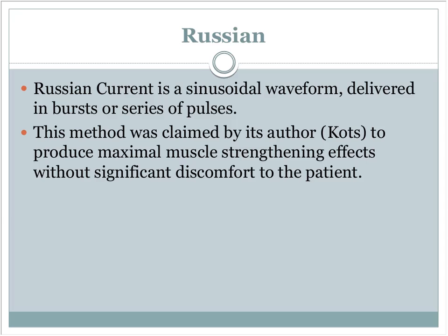If it doesn't work, try something else. It doesn't mean they won't respond to e-stim. It means they may not respond to that form of e-stim. That's why it's important to understand the waveform differences and that there are differences. Not that you have to be able to memorize what the waveforms are, but just really an understanding that they are different and the body will respond differently to different waveforms.